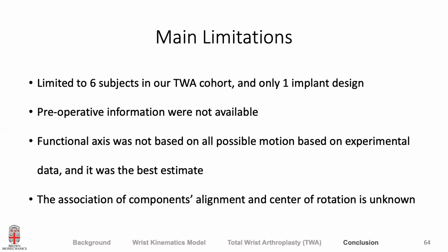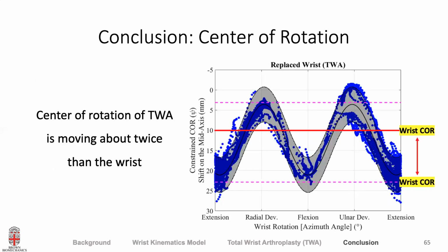And also, because of our sample size, we didn't evaluate how the alignment of the implants affect the center of rotation location. And detecting this variation wasn't possible for us because we only had 6 subjects.